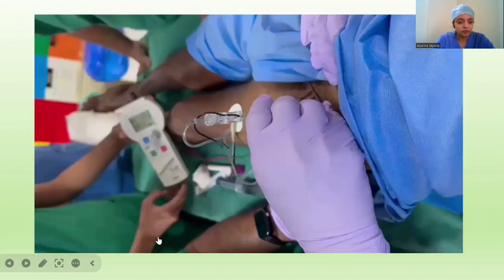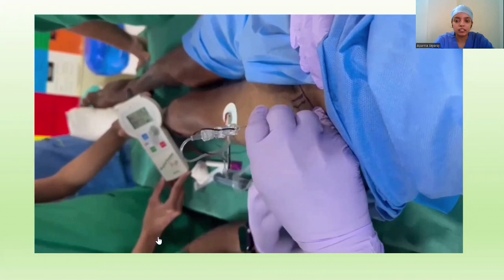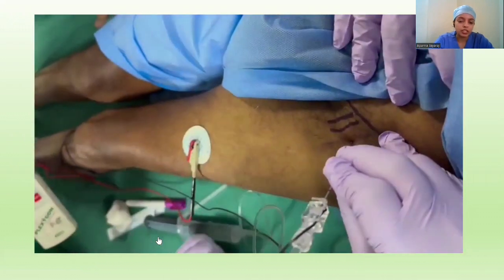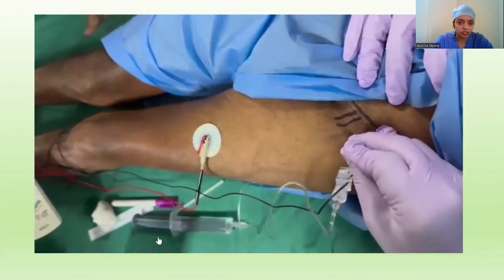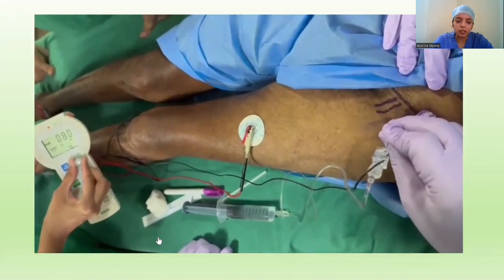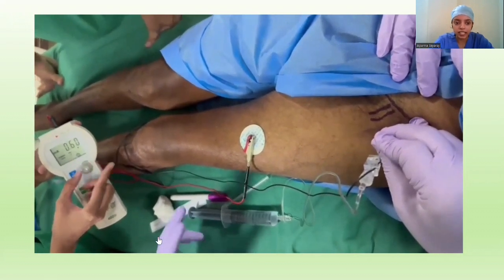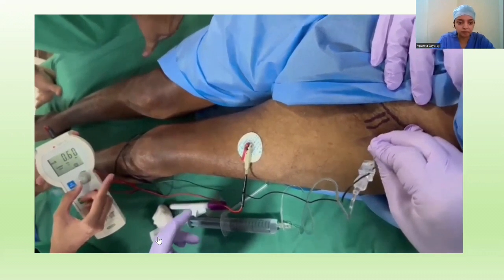Let's see a video of a femoral nerve block being performed. As you can see, the needle is inserted lateral to the femoral artery and the initial current is around 1.5. We look for the twitches of the quadriceps muscles, and you can see the patellar twitches. Once the desired response is seen, the current is reduced to elicit the response at 0.3 to 0.5. You have to make sure that the response is gone when the current is less than 0.3, because that indicates intraneural placement of the needle tip.